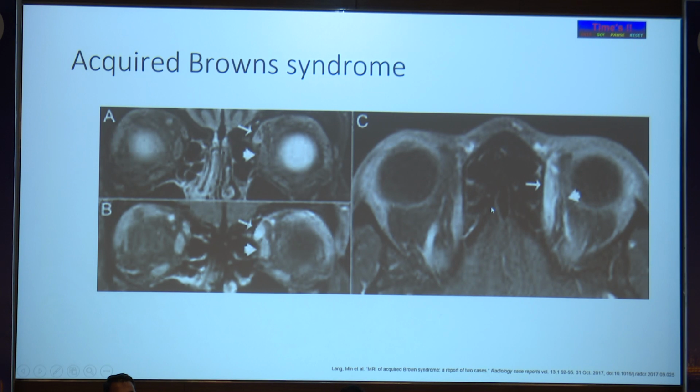And similarly, whenever a patient comes with a complaint of torsional diplopia or limitation of elevation in adduction, simulating Brown syndrome, you want to find out why Brown syndrome has happened suddenly in an adult. So you can do imaging to identify any sinus pathology. You can easily identify any sinus pathology in MRI. If there is any sinusitis, if you treat the sinusitis, the condition might resolve. If it hasn't resolved, then you can give a triamcinolone injection in the superior oblique region to reduce the inflammation.